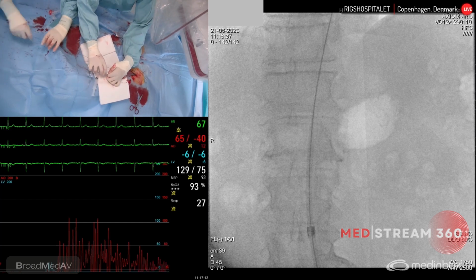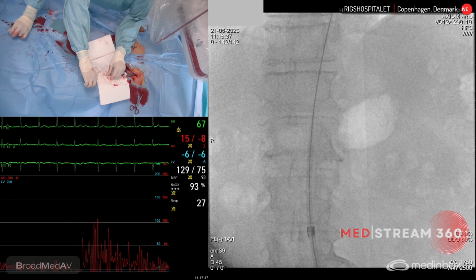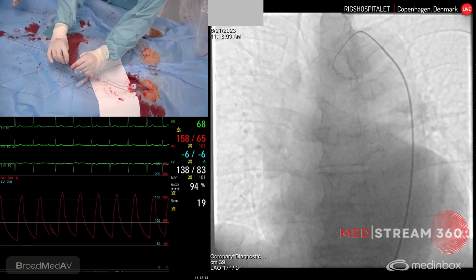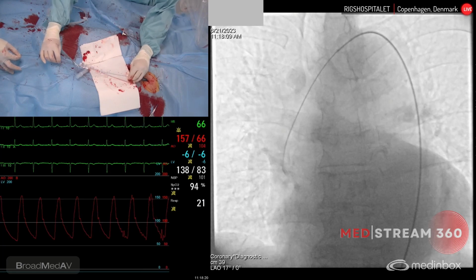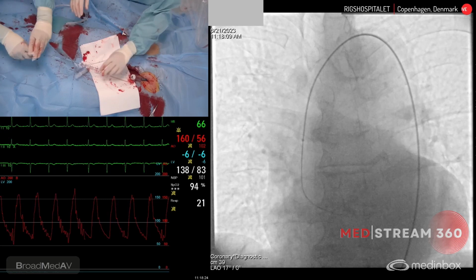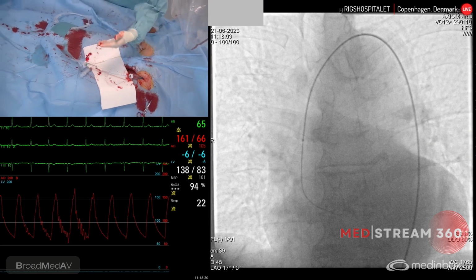You're going to put the L1 on now, just to get this over the arch, and that will align the aortic arch, which we're then going to use to deploy the Sentinel as well. You see the aorta even without contrast. There's a lot of calcium there, so I think it's justified to use Sentinel here. Okay. Good. I'm here with the Sentinel for you guys.